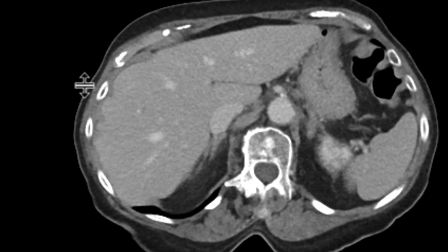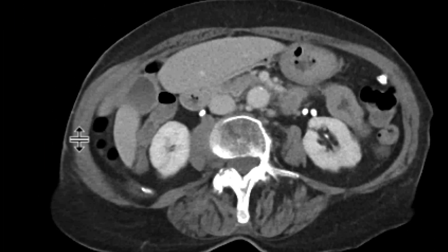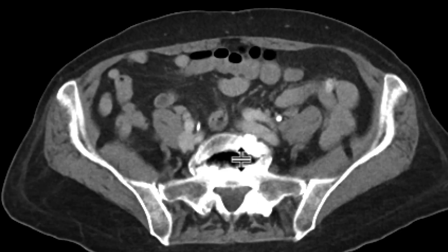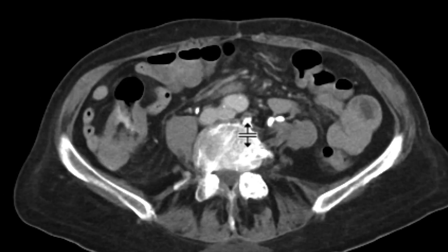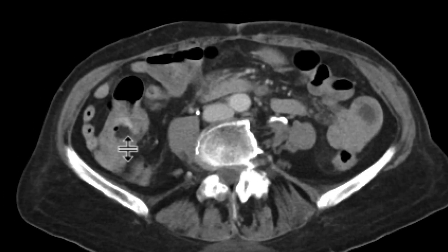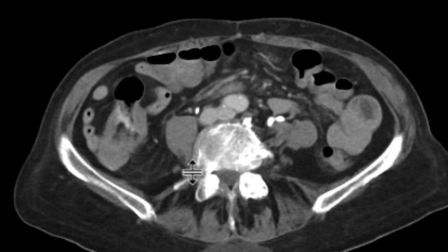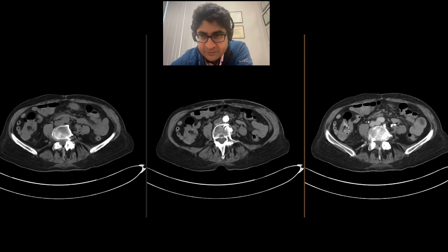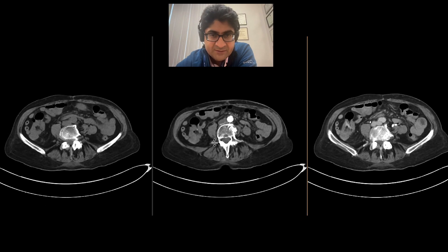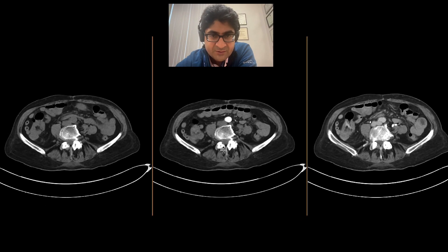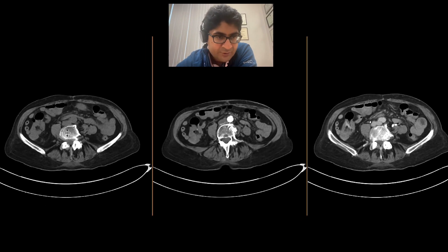And we'll go to our delayed phase. Going back to that ileocecal region, you can actually see there's the fatty valve there. There's some high density adjacent to it, going inside the bowel lumen. Here's that high density there adjacent to the ileocecal valve — and looking back, no high density was present on the non-contrast images.